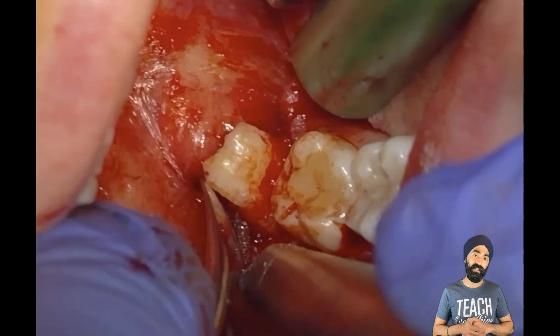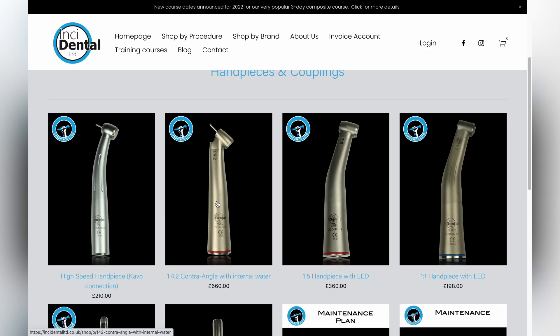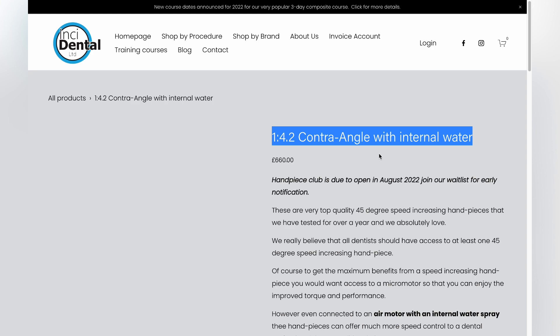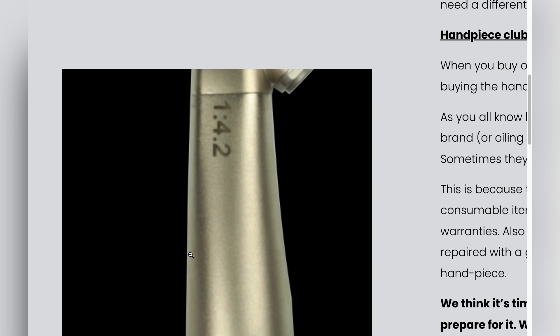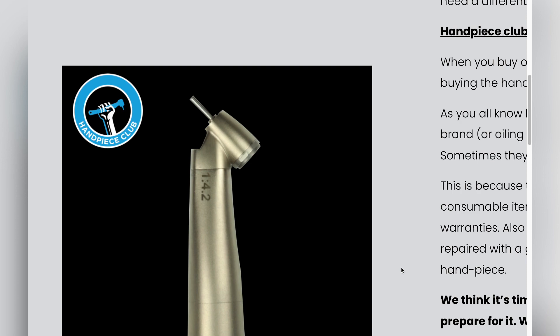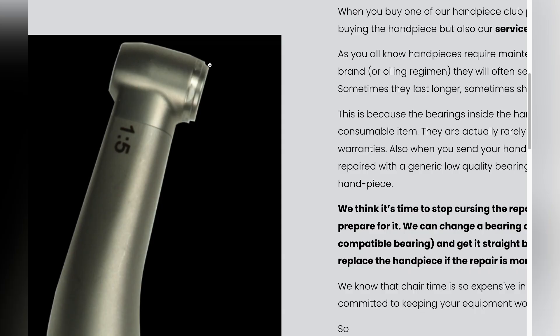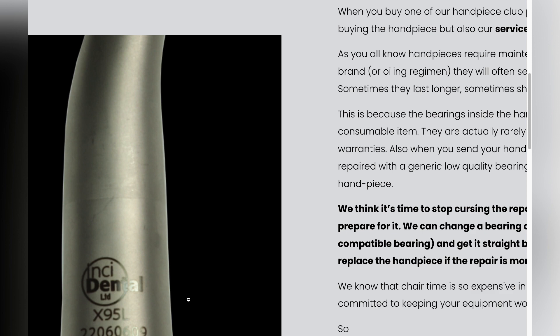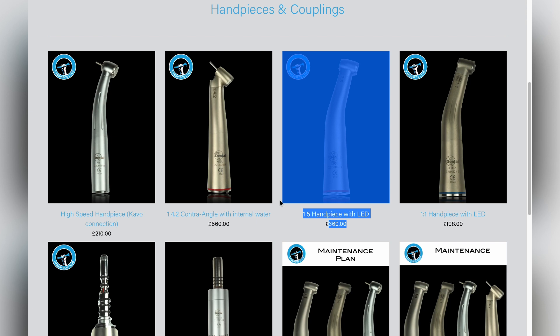I'm going to start sectioning again — get that buccal flap out of the way, nicely irrigated. I've been getting a lot of questions about which handpiece I'm using. This is a 45-degree angled handpiece, brilliant for surgical extractions for the access it gives you, but you can also use it for restorative dentistry. This is a speed-increasing red-band handpiece — an electric handpiece — and I recommend it for restorative and surgery. When I bought mine they were £1,200 in the UK; I was in Singapore and they were £700 on offer so I bought two: one angled and one regular. Chris O'Connor from Incidental Limited has started a revolution — these same handpieces at a greatly reduced price: £660 for the angled.